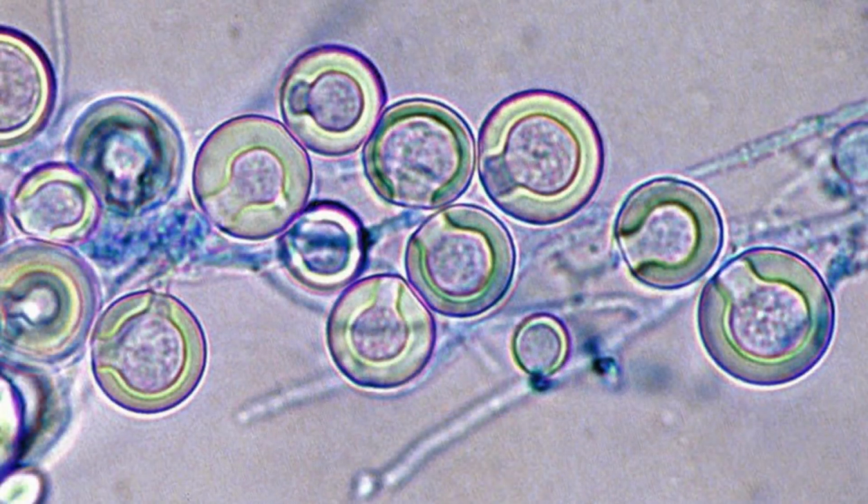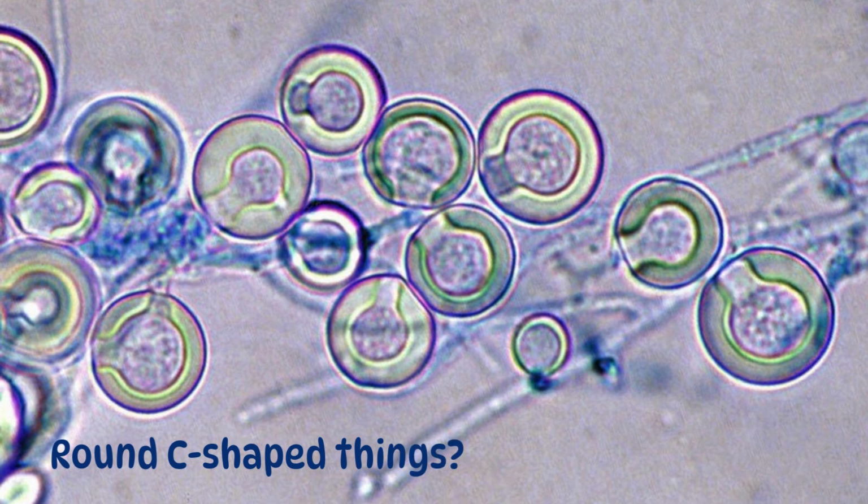Applying tape to a mold and then onto a wet drop of dye on a slide presents a certain learning curve. Don't give up. This hurdle can be quickly overcome. It's the microscopic exam that follows where students often hit a roadblock. Translating what you see into terms and then an identification can be quite challenging.